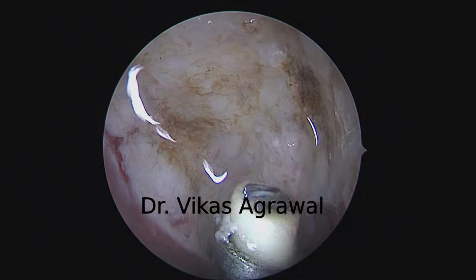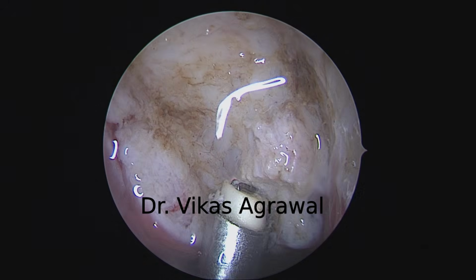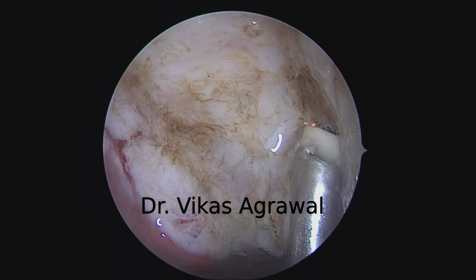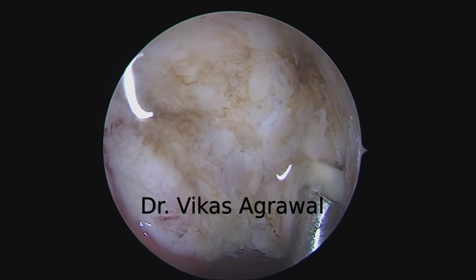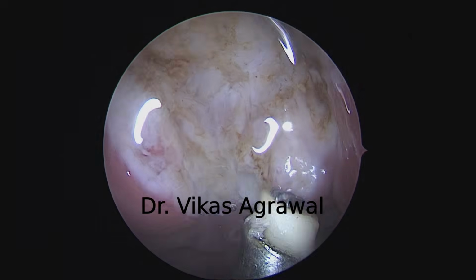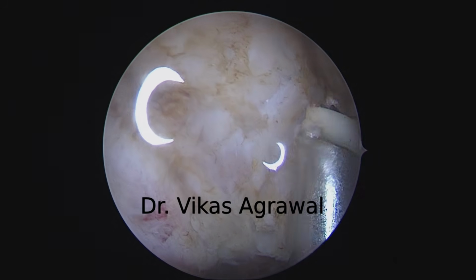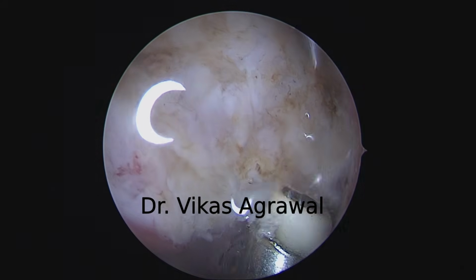So we need to remove the posterior, the lateral boundary also completely. This is the bulk of the lymphoid tissue. I'm now behind the torus tubarius and removing the lymphoid tissues completely. That's the inferior part, the Passavant's ridge area.